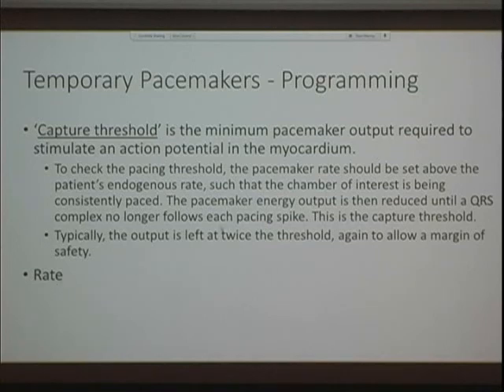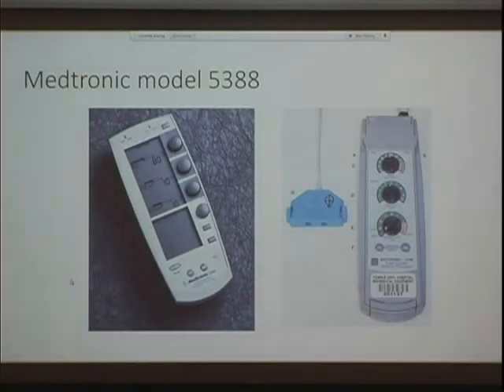And rate is always available. Rate response is sometimes available. And the rate has to be set. Generally, post-op is at 80 beats a minute. This is what the pacemakers look like.